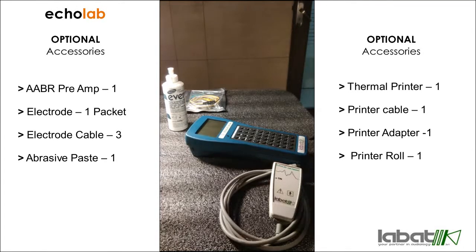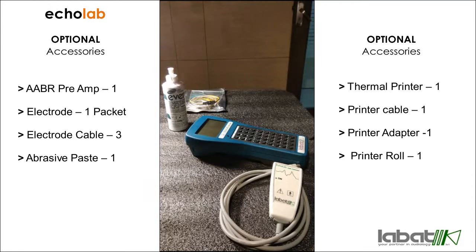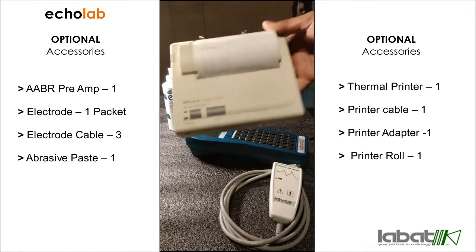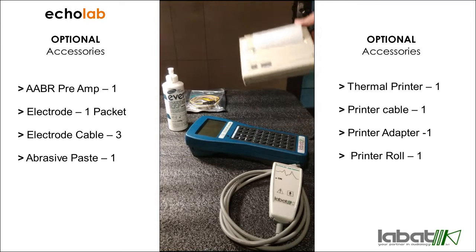You can take the printout using a thermal printer, so you get a thermal printer along with the Ecolab. Here it is, it comes with a paper roll that is inside the thermal printer.